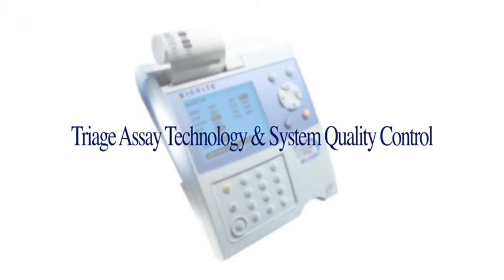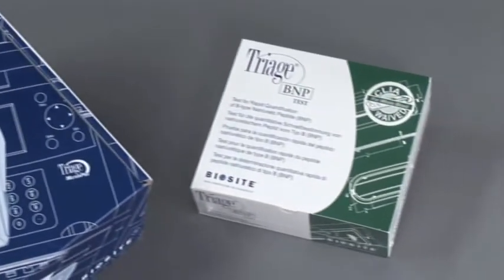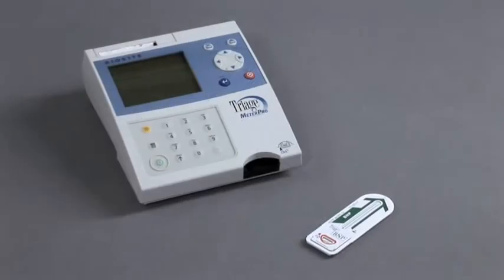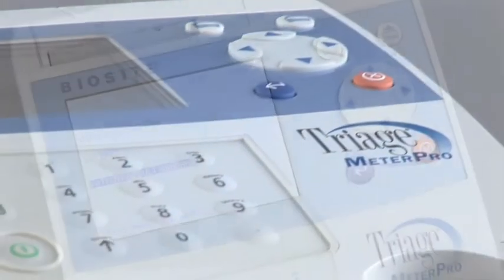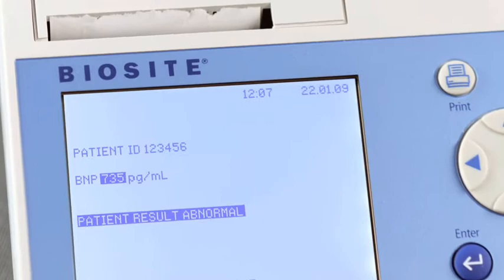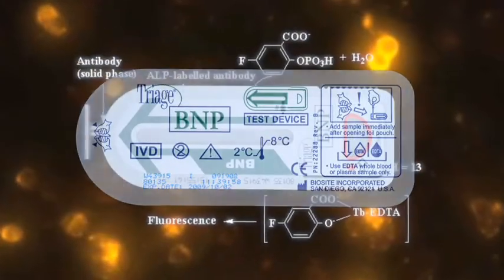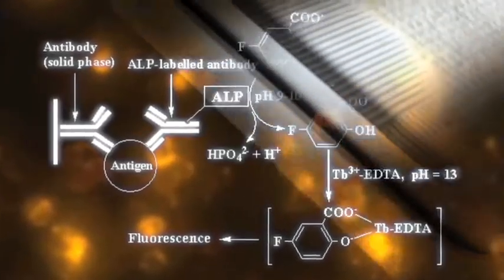Triage assay technology and system quality control. The triage system is comprised of two basic elements: triage meter and test devices. These two elements are highly engineered complex components, designed to ensure consistent and precise test results in a variety of clinical environments.